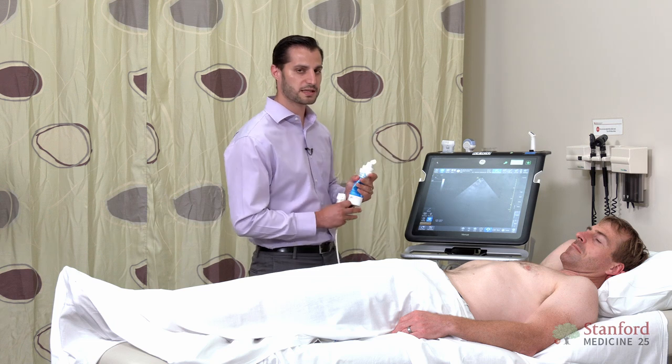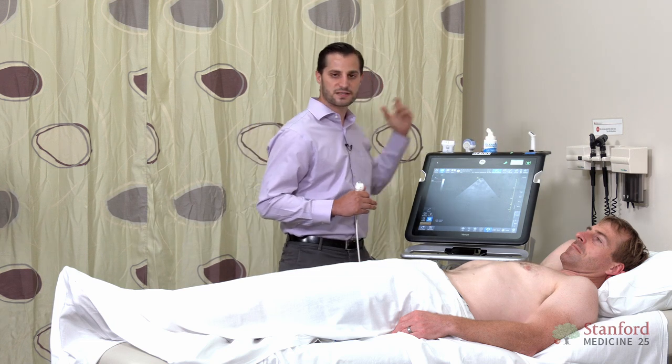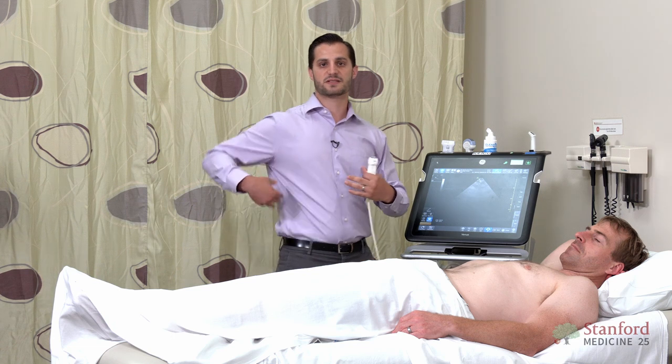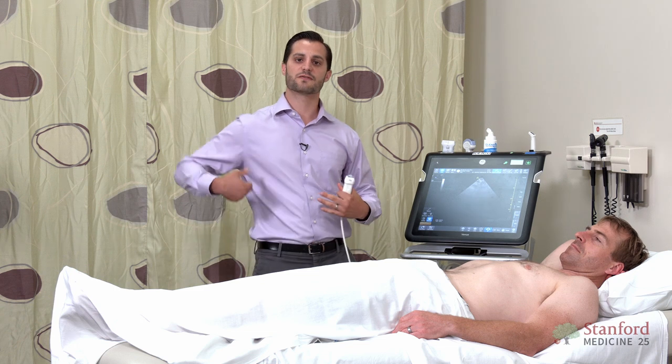The patient should be lying flat in bed, and there are two areas that you can be scanning. The first is in the mid-axillary line, and the second is in the lower abdomen. We'll start first with the mid-axillary line.